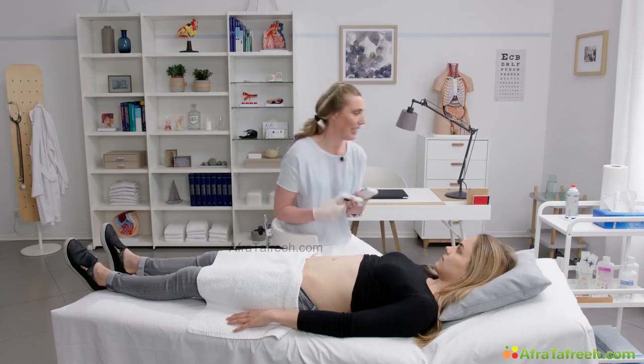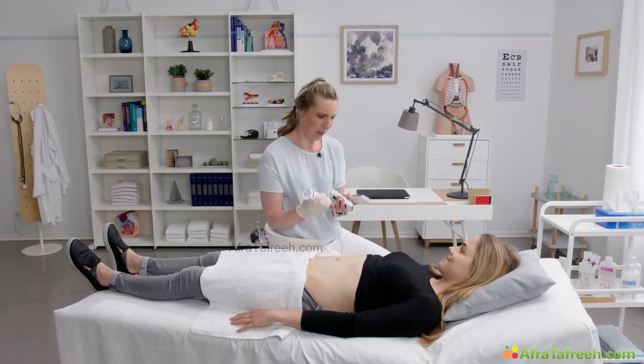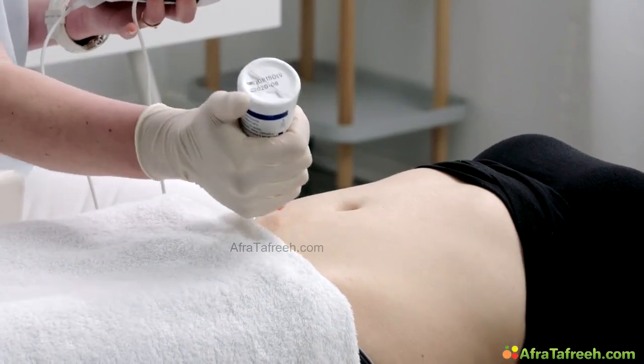So let's start the scanning now. I'm going to put a little bit of gel on your belly. It's going to be a little bit cold. Sorry for that.